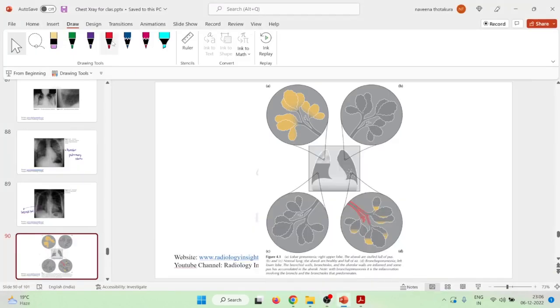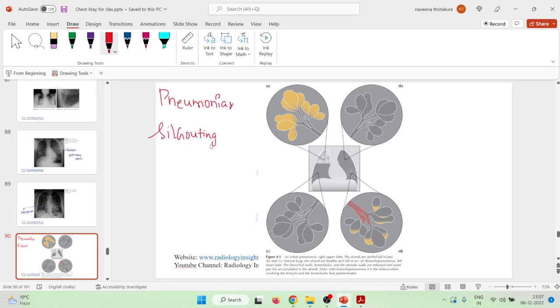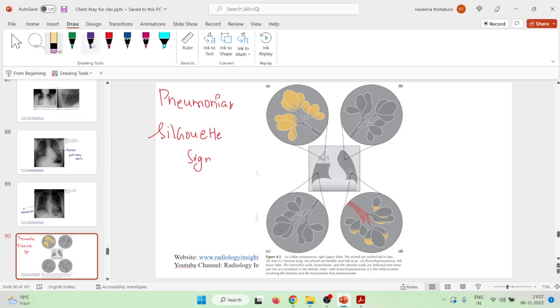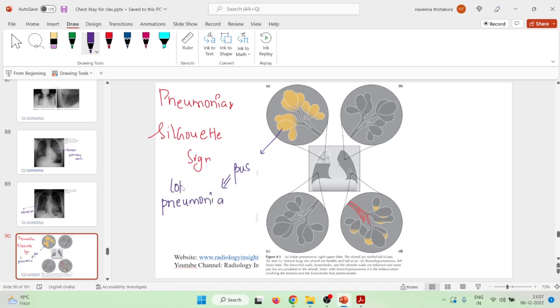Hello friends, let us now learn some important points about pneumonia and a sign called the Silhouette sign. Looking at pictures of the alveoli, we can see that when alveoli are filled with pus, it is obviously pneumonia — specifically lobar pneumonia. If the alveoli are filled with pus, it is lobar pneumonia.